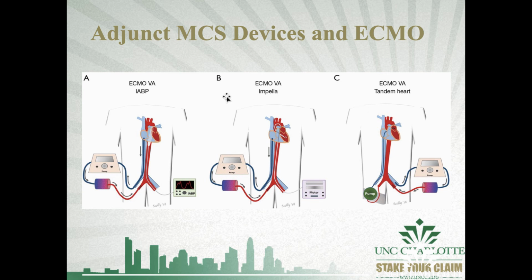I haven't worked much with the tandem heart, but the Impella, what we do here is the Impella goes in here, and it's going to help reduce LV distension with our retrograde flow. Okay, so instead of putting a vent in there, it acts as a vent, and it will propel blood out of that area into the aorta and augment this antegrade flow in respect to this retrograde flow. The balloon pump is going to help augment our cardiac output as well and provide a source of rest. We're going to leave it at that, but we can have ECMO here with the balloon pump. So during diastole, our pump is filled up.